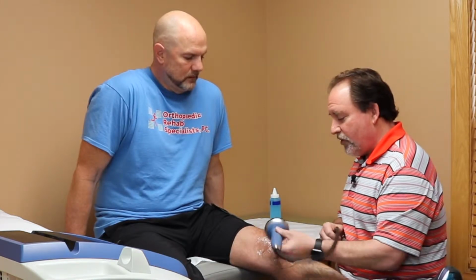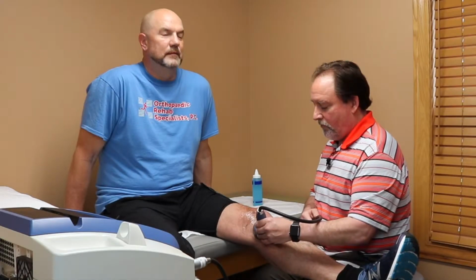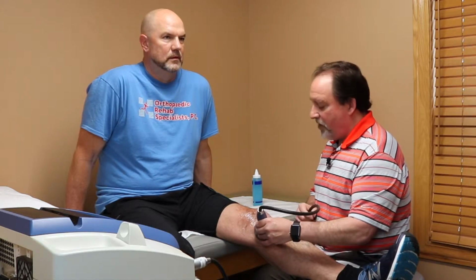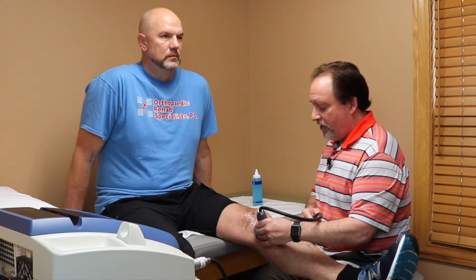Okay, so as we start. Yeah, there it is, right there. It's easy to slide off the spot, so that's why we need communication. That's it. And you have to keep me on the spot. Intensity-wise, we can increase the intensity if you just barely feel it. We can decrease the intensity if it's too much.